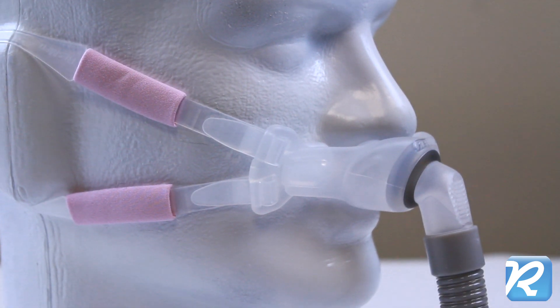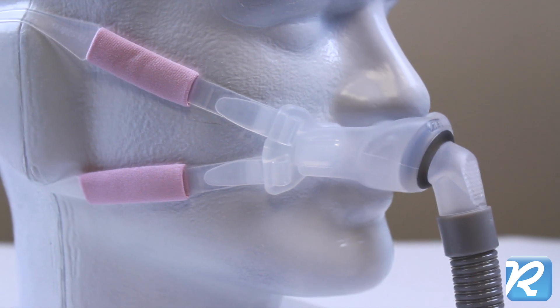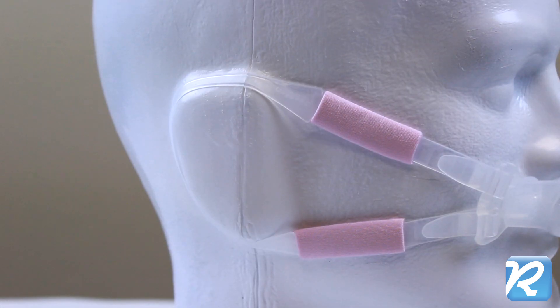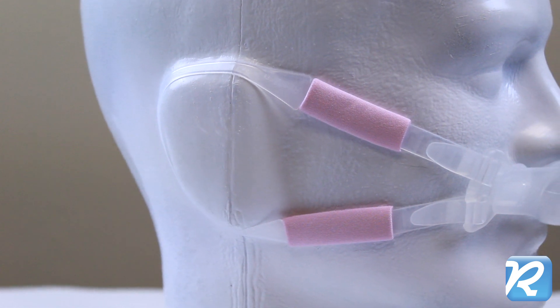The Bella ear loops hook to the springy nasal pillows at the lock and key connection and feature pink fabric cheek wraps. The Bella loops adjust with Velcro over and under the ears.